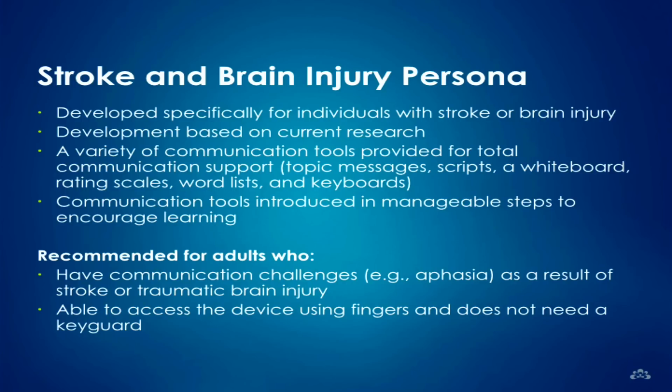I didn't mention the scripts, but there are some built-in scripting tools, so that person can practice scripts around a particular topic and helping them to work through conversation. So if they're going to the doctors and they wanted to make sure that they covered certain things, they could work with a communication partner or other supports to develop that script and then be able to practice that before they go to the doctors and use it when they go to the doctors. So the scripts are really helpful as well. This is for adults who are going to access the device using their fingers or a stylus. So this one doesn't allow for a keyguard or for scanning.